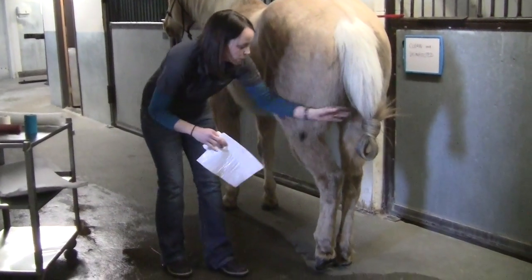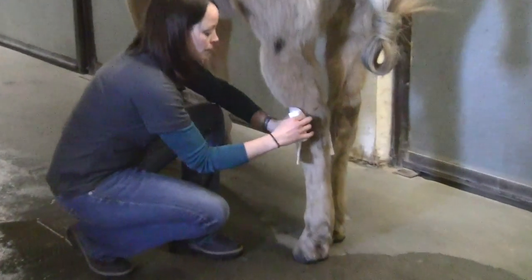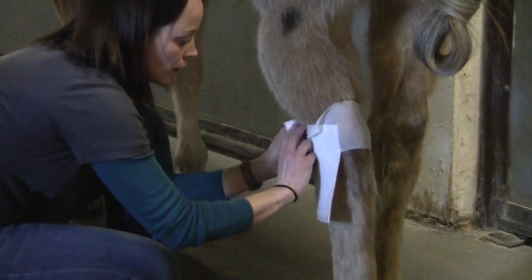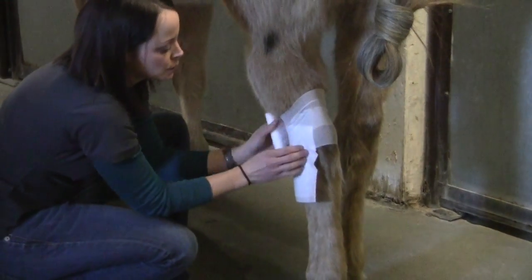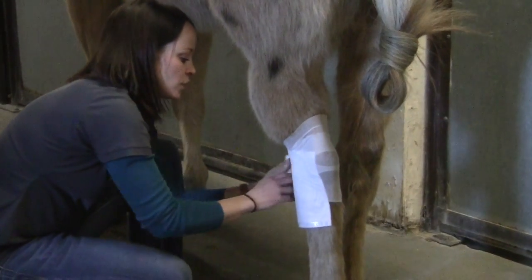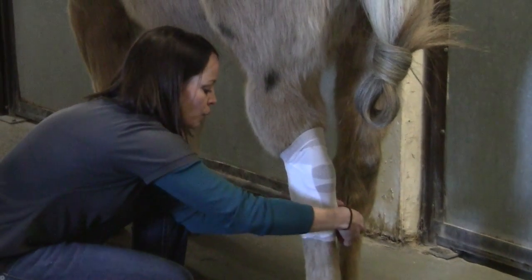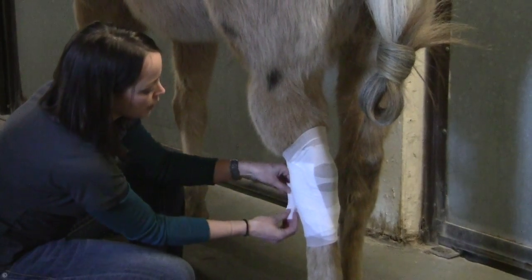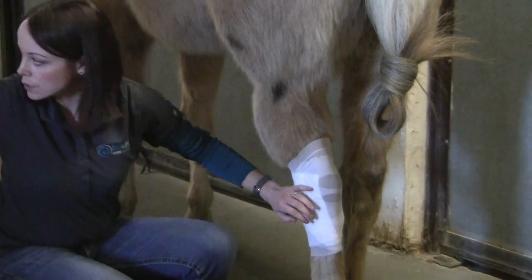Most of the time the wounds are on the face of the hock, so you'd wind up putting your telfa on the front of the hock and then hold it in place with the white gauze. One of the most common complications with bandaging the hock area is pressure sores on the face of the hock, so you do want to be careful. I'm going to show you a few tips to try to prevent getting pressure sores over the point of the hock. For this layer we're essentially just trying to get our non-stick dressing to stay in place while we put the other layers on.